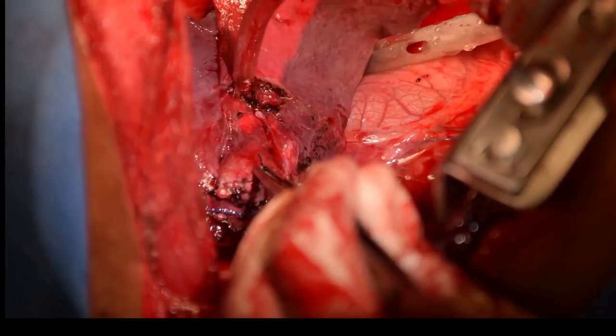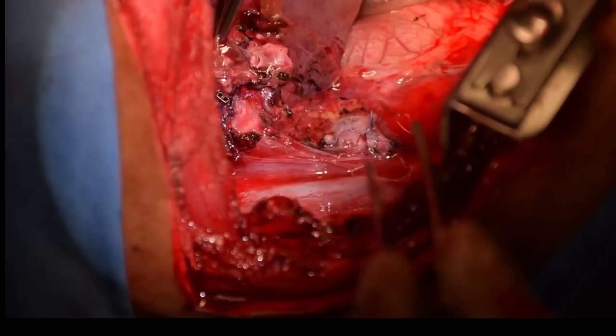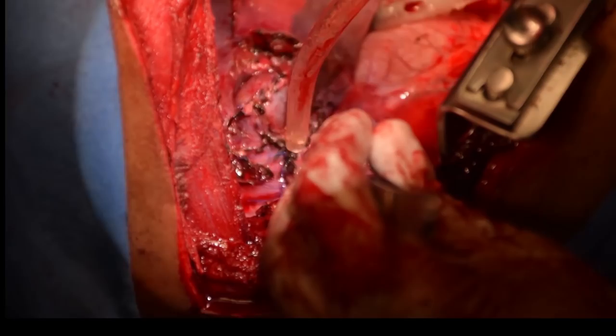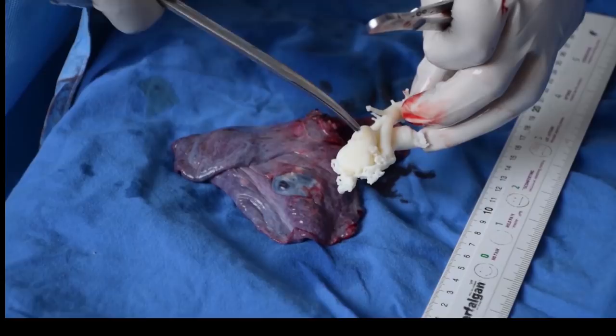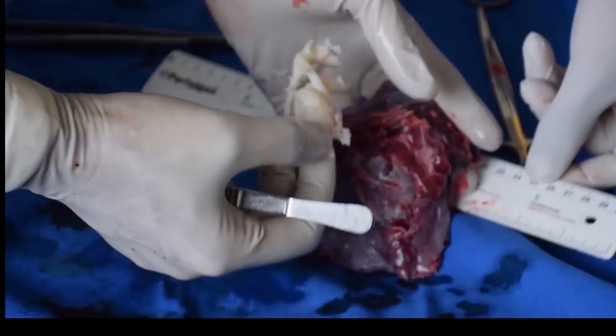That is the bronchus which was stapled, and that is the inferior pulmonary vein repaired, opening directly into the left atrium. We are superimposing the 3D print on the specimen, showing the exact similarity in size and composition. We were quite impressed with the accuracy of the 3D print. This is the AV malformation opened up, showing where it had communicated with the bronchus — which explains the hemoptysis.